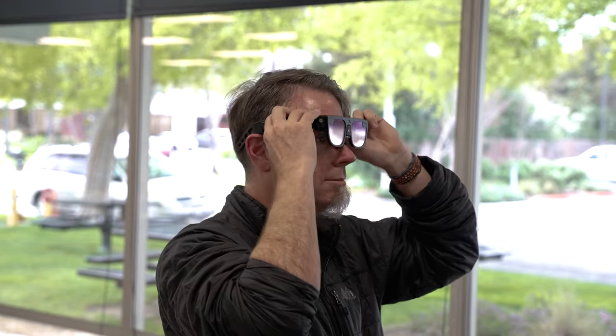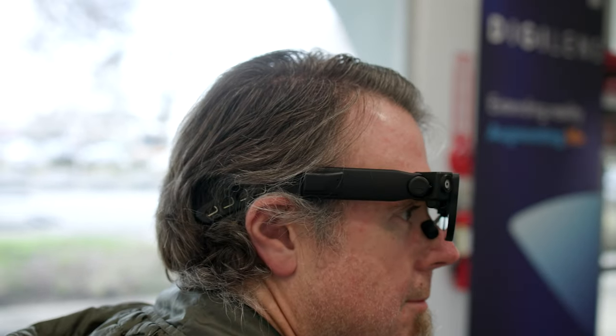Once the big adjustments are done, slide Argo over the top of your head. The arms should be right above your ears and the ear horns should grab at the back of your head.